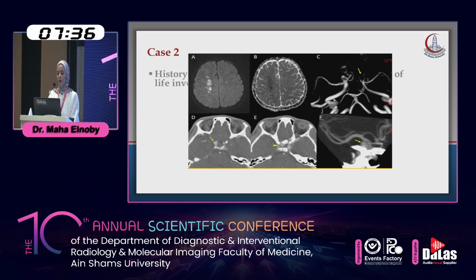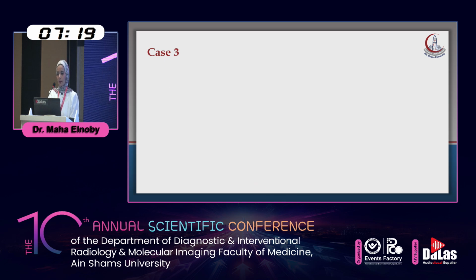When it was done after 3 weeks, we found that CT angiography shows a bilobed aneurysm, supraclinoid and cavernous portions. When CT angiography map was done, it's a pseudoaneurysm in the supraclinoid portion. This is grade 3. Pseudoaneurysm is grade 3.